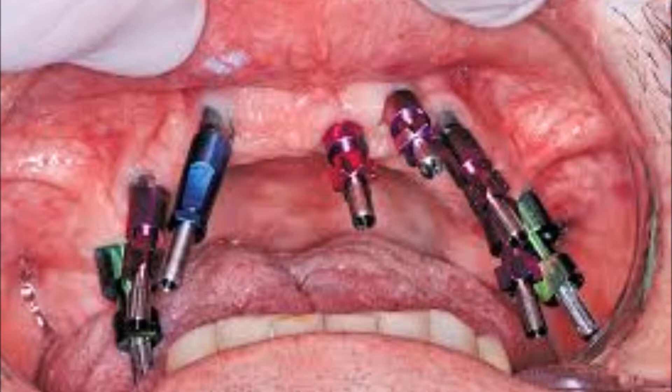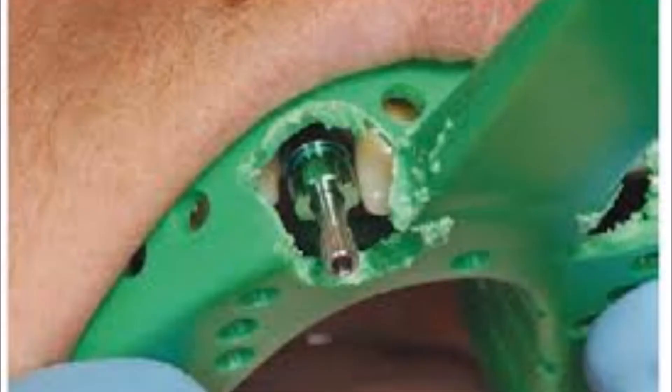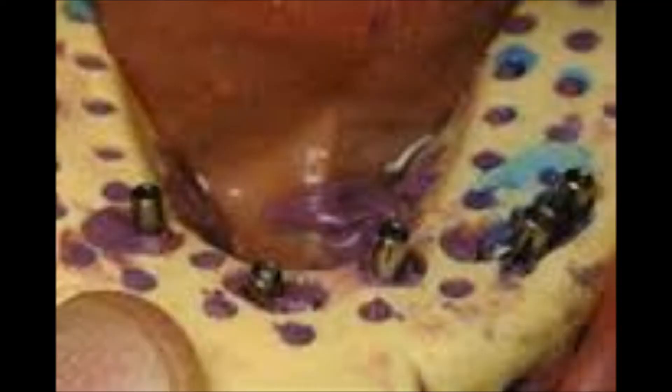Transfers slow down the flow of impression material inside the tray, resulting in voids and inconsistencies. Closed tray transfers such as plastic copings are even less accurate due to their elastic properties. Snapping analogs into these copings often requires excessive force that can easily dislocate them, compromising the accuracy of the whole impression.